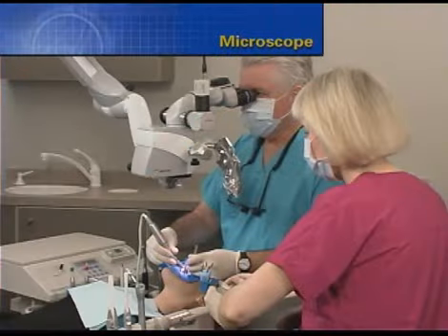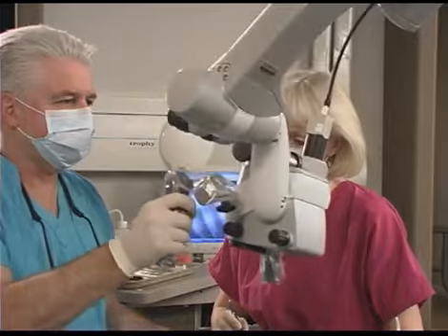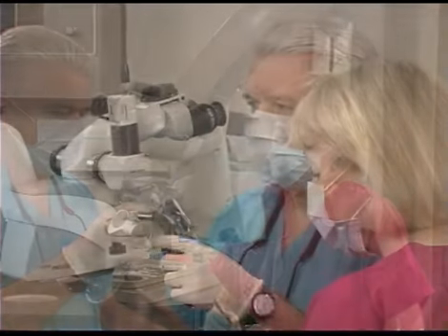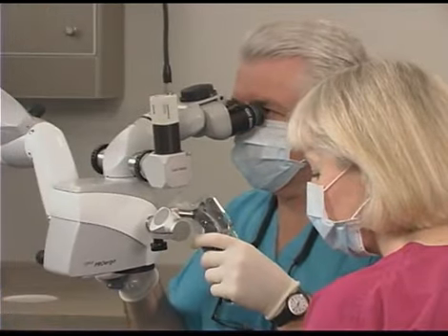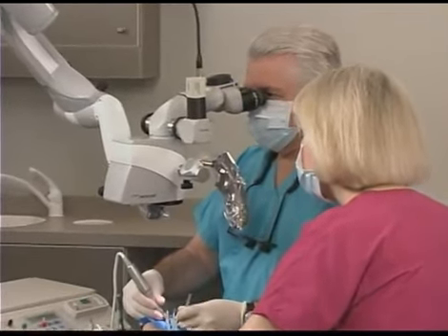The dental operating microscope is a critically essential part of the armamentarium in non-surgical retreatment. In my experience, Carl Zeiss has a line of superior products. Specifically, the Pro Ergo has magnetic clutches. This feature, in conjunction with rotatable and inclinable oculars, allows us to get into great position for patient care.